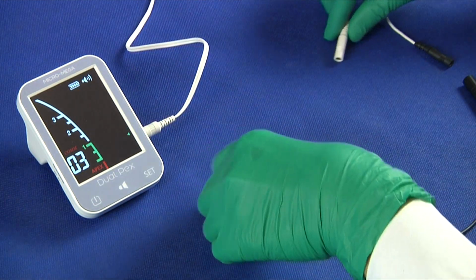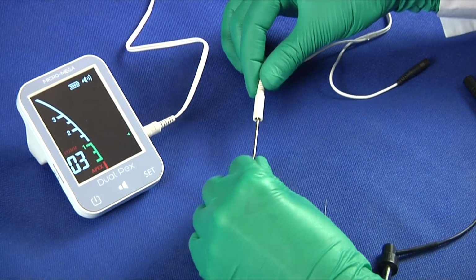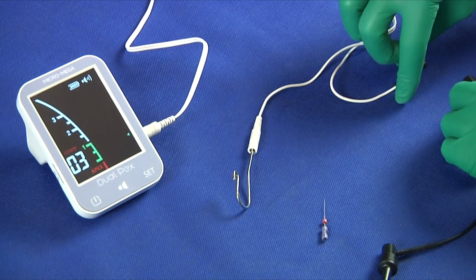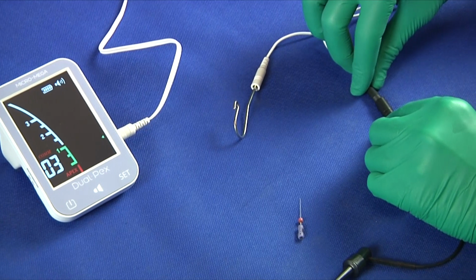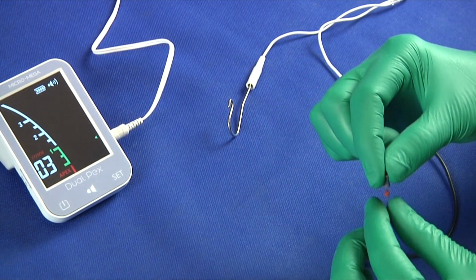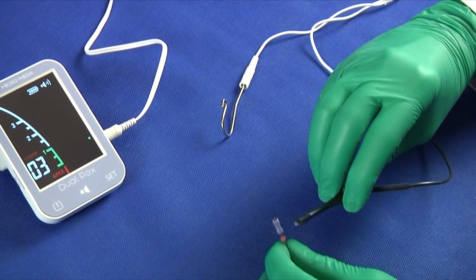Insert the measuring wire. Connect the lip hook to the white socket of the measuring wire. The lip hook will be hung to the patient's lower lip. Connect the file clip to the black socket. Finally, put the clip to the manual file to explore the canal.